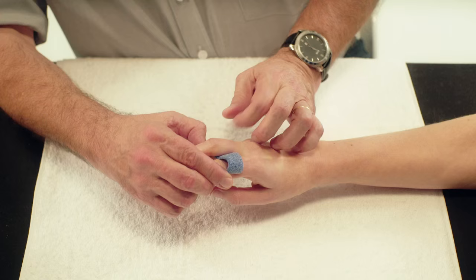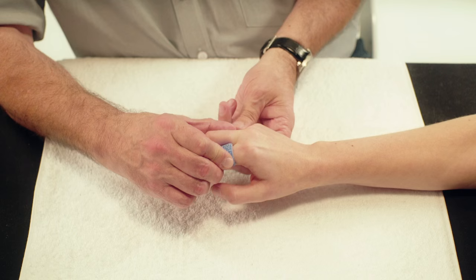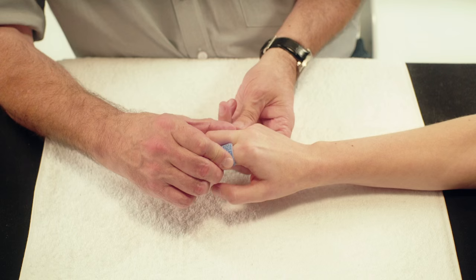The orthosis can now be fitted. This orthosis allows finger flexion but will protect the extension system of the middle finger during flexion of the long fingers.